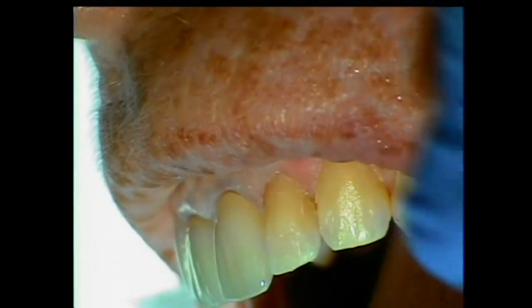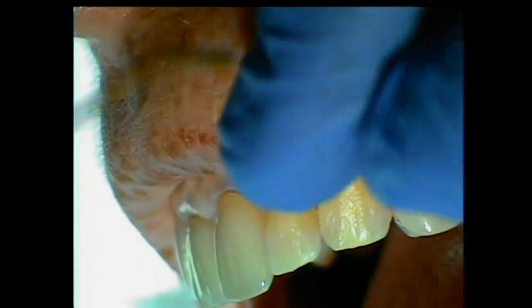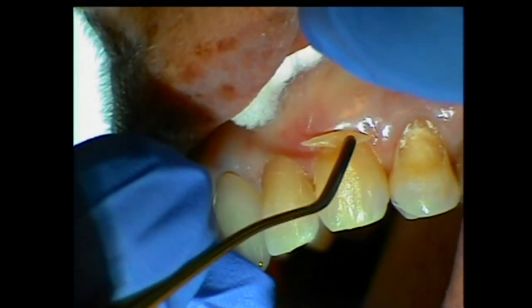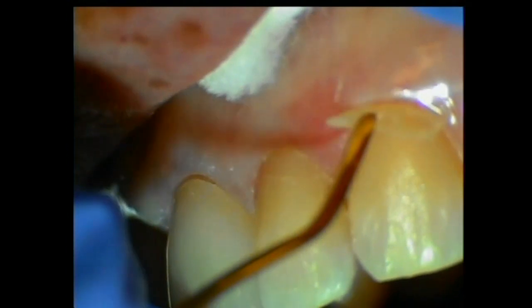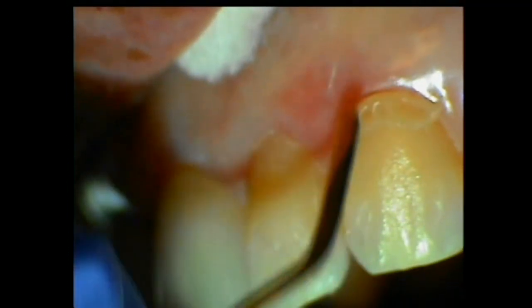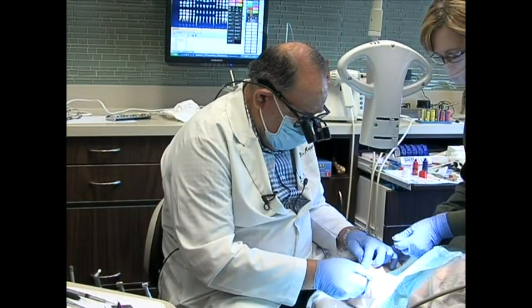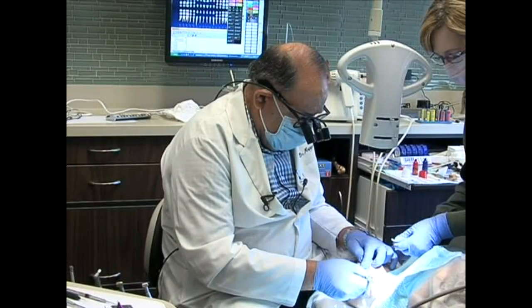Before sealing the margin, a quick light cure. I just have a little ellipse of material — I roll it at my fingertips, bring the material to the gingival aspect of the tooth, and milk that right underneath the free margin using this instrument. You can see the way this blade goes right underneath the free margin without damaging tissue.